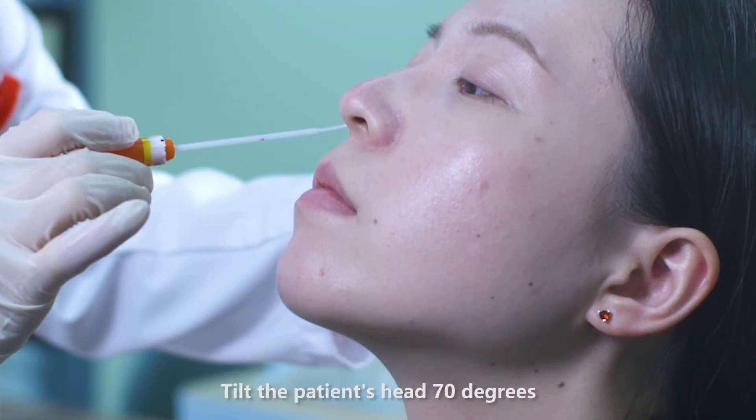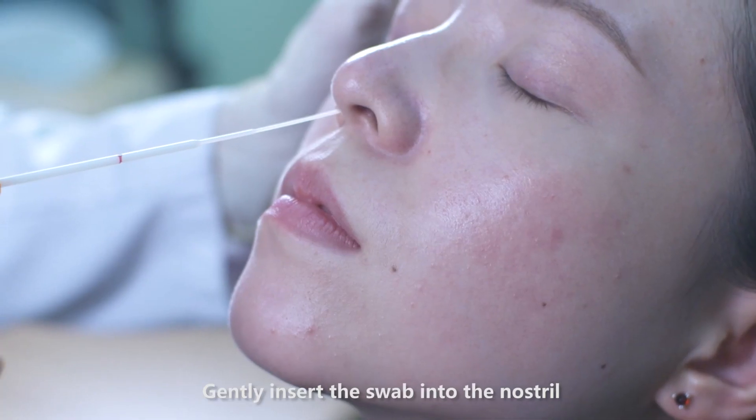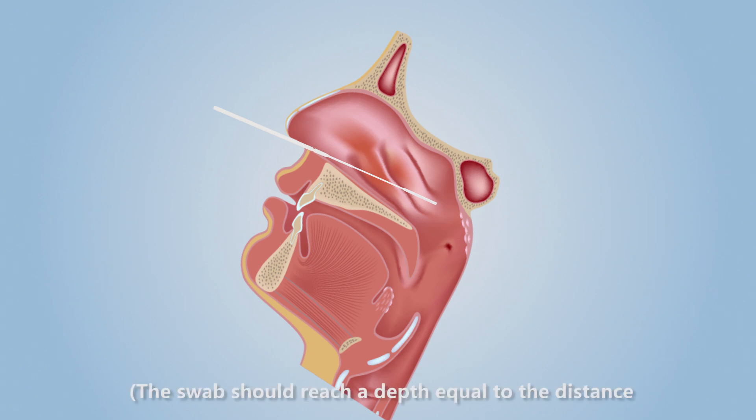Tilt the patient's head 70 degrees. Gently insert the swab into the nostril. The swab should reach a depth equal to the distance from the nostrils to the outer opening of the ear. Leave swab in place for several seconds to absorb secretions. Slowly remove the swab while rotating it.